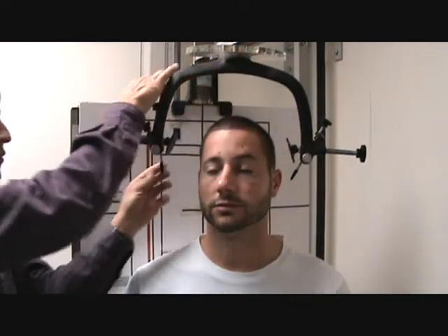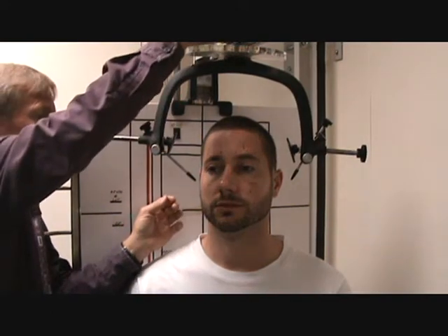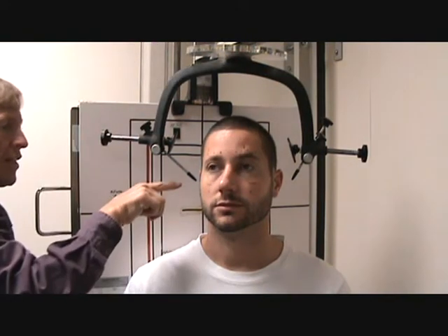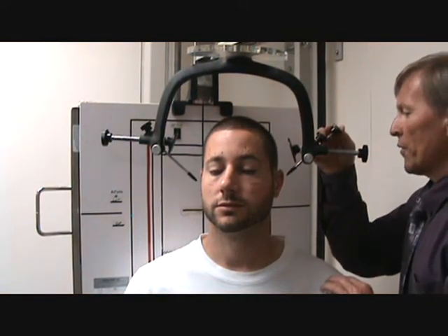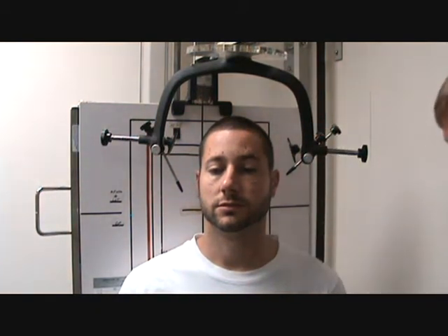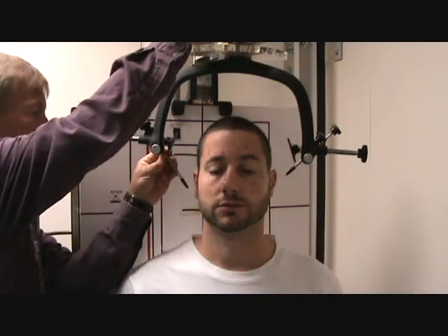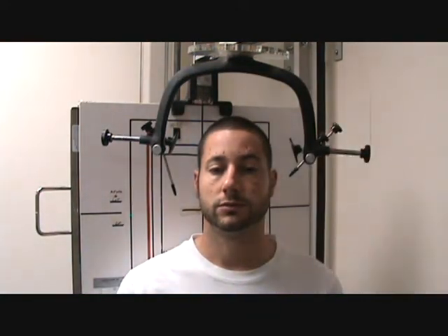We'll loosen up the head clamp and take this ear pointer, with the turn at 26 degrees, and line it up with the posterior wall of the auditory meatus — or in this case, the tip of the tragus. It's lining up to the tip of the tragus on this side; I need it doing the same on the opposite side. As I put my pointer in, I see that this auditory meatus is too anterior by about a half inch, so I'm going to rotate the patient. I'll rotate them a little bit more to make sure both sides are lined up, giving us the patient turned 26 degrees.